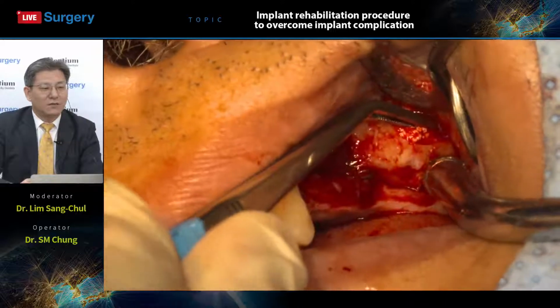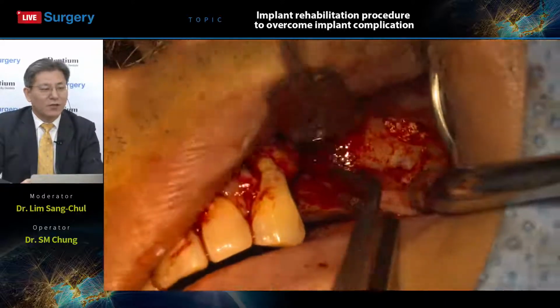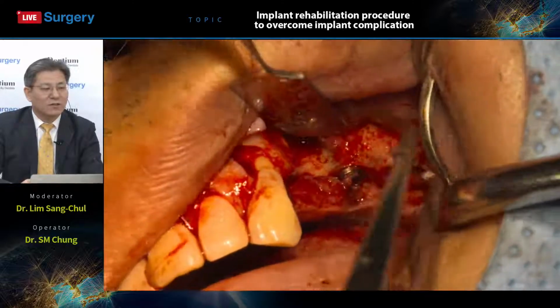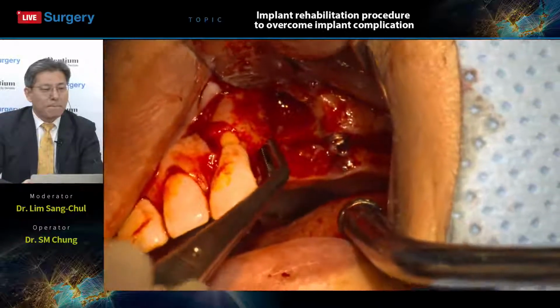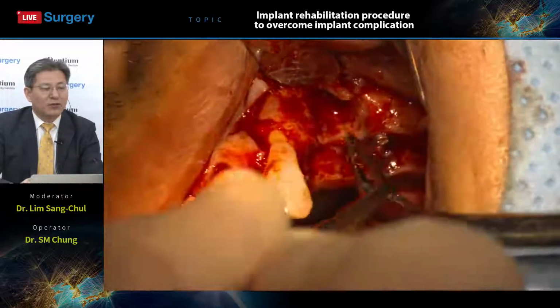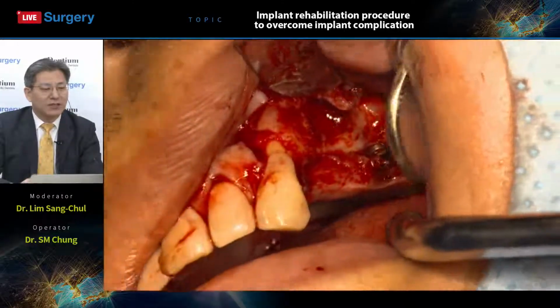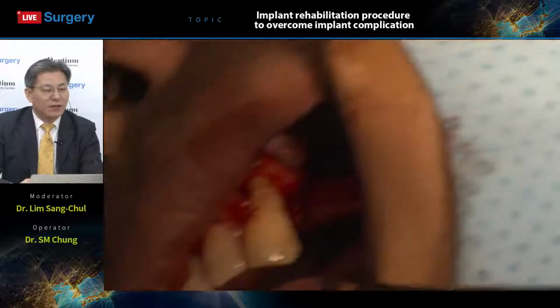Okay, so this should be enough. Yeah, Osteon 3 collagen, palette type. Put the Osteon 3 collagen into the cavities already made after the sinus membrane is elevated.